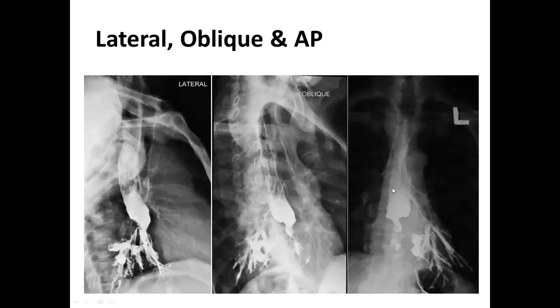and it comes back to the esophagus, to the oropharynx, to the pharynx up here, finding its way into the larynx after the epiglottis relaxed back to its normal position. And this contrast goes beyond the main bronchus, and the lower lobe is the only one which is severely affected in this type of aspiration.